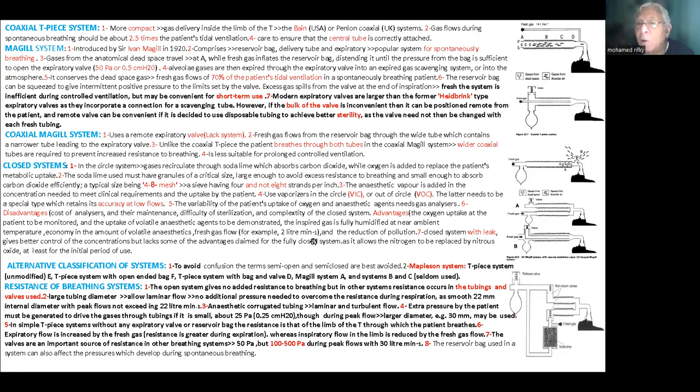But the disadvantage is a complicated system made of many parts which may be dislodged and cause leaks, and it's difficult to sterilize.